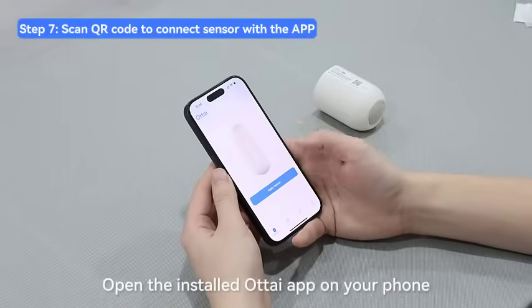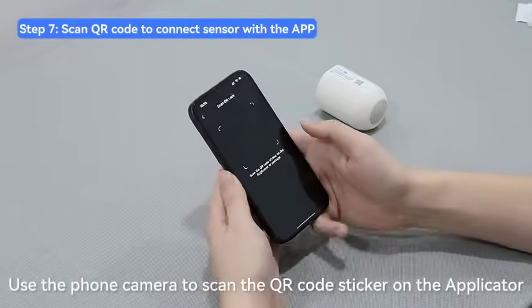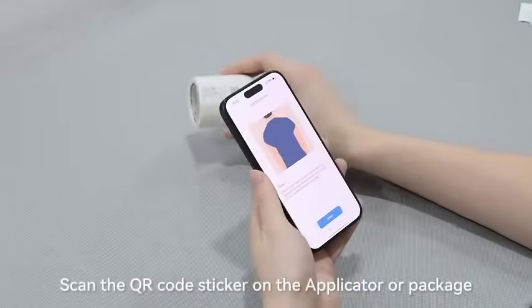Open the installed Otai app on your phone. Use the phone camera to scan the QR code sticker on the applicator or package to verify your sensor.